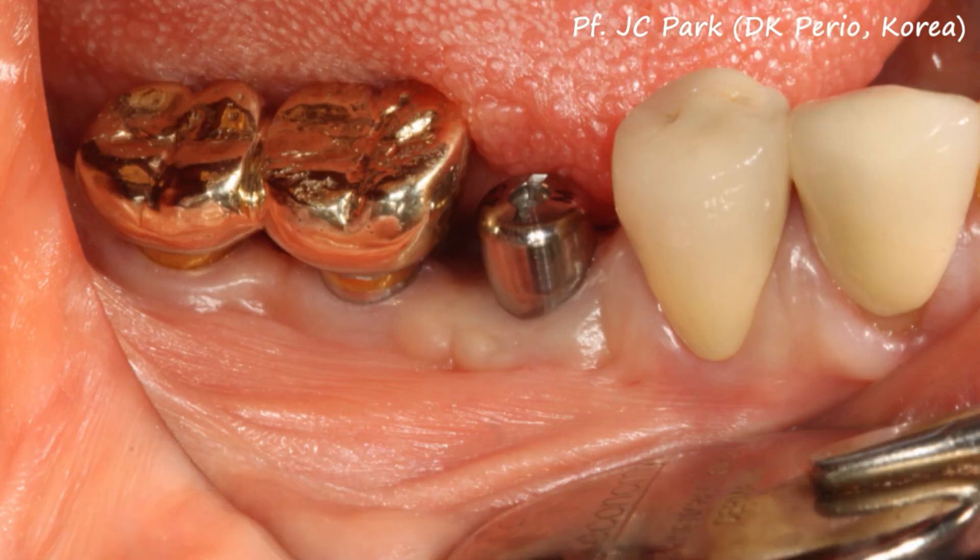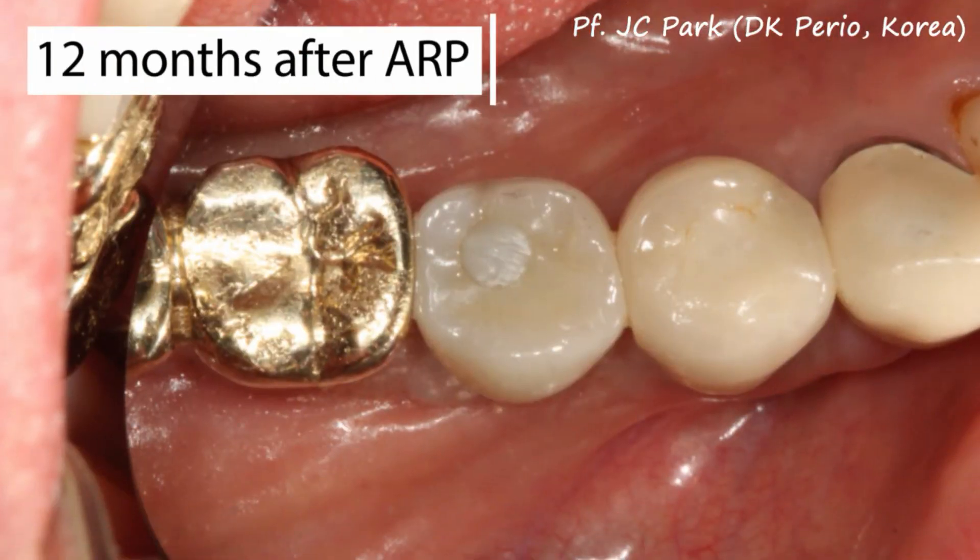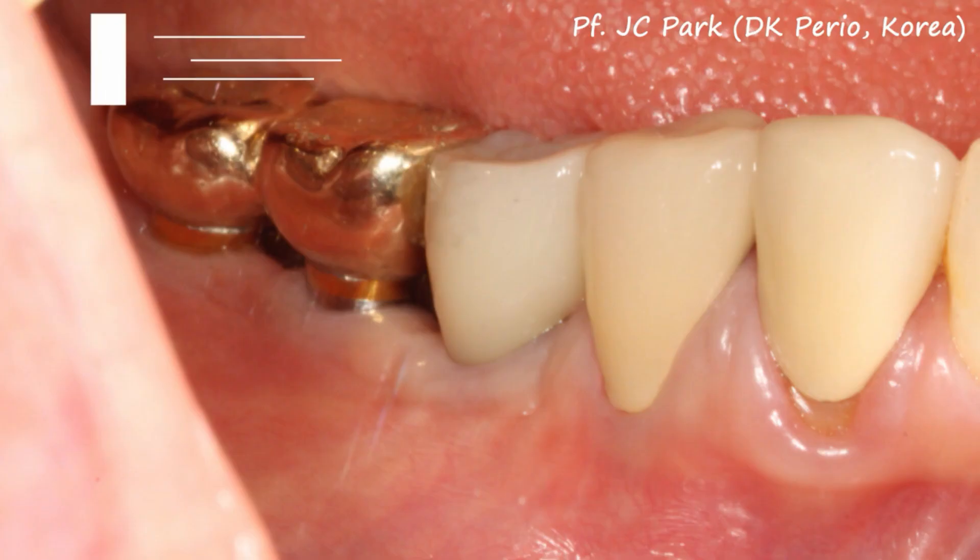To compare before and after, you can see that the keratinized tissue is nicely healed. And this is the after final crown.